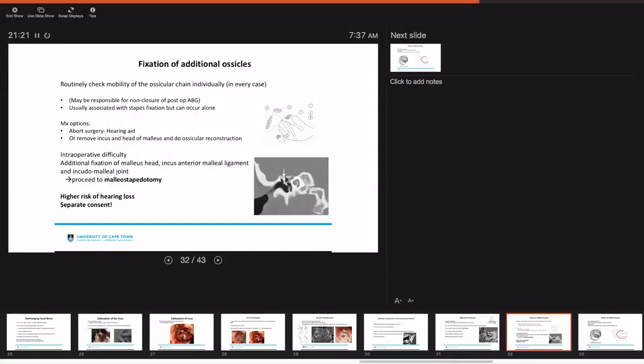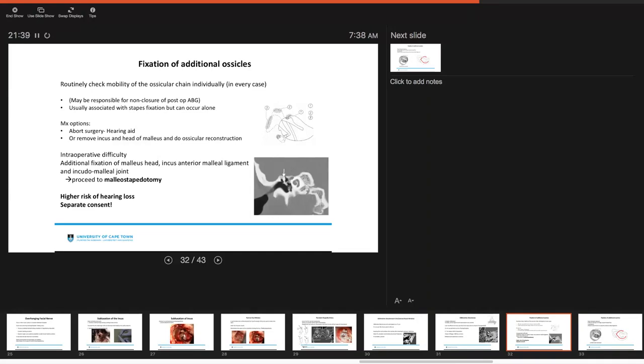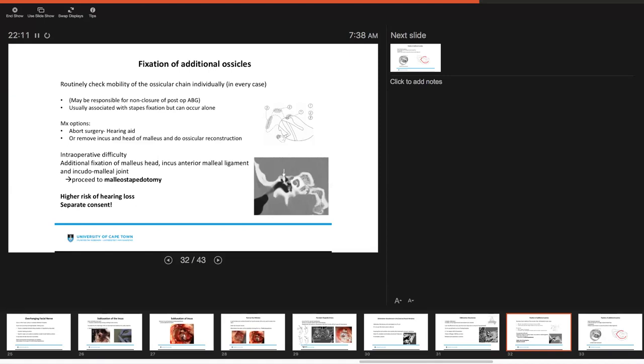You always want to check for any evidence of fixation of any of the additional ossicles. This should be done routinely where you assess the entire ossicular chain individually in every case and if you don't have, this may be one of the reasons that you have non-closure of your postoperative air bone gap. It's usually associated with stapes fixation but it can also occur alone. Management options if you have fixation of additional ossicles are either to abort the surgery and offer the patient a hearing aid or to remove the incus and head of malleus and do an ossicular reconstruction. The intraoperative difficulty experienced is that you may have additional fixation of the malleus head, the incus anterior malleus ligament and the incudomalleus joint. Here you'll need to do malleostapedotomy. With malleostapedotomy there is of course a higher risk of hearing loss so you must add this in your consent form independently.